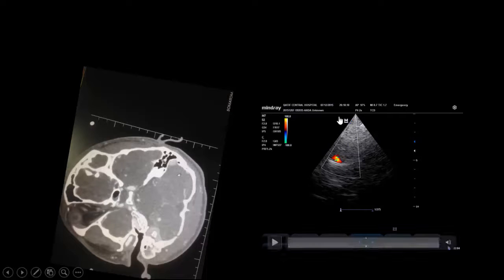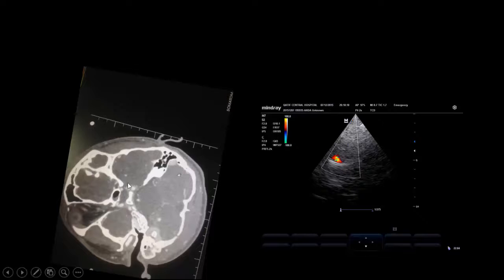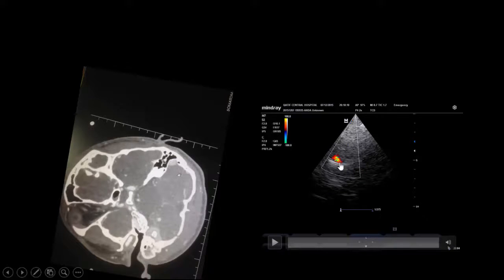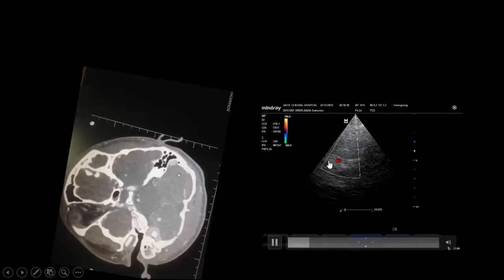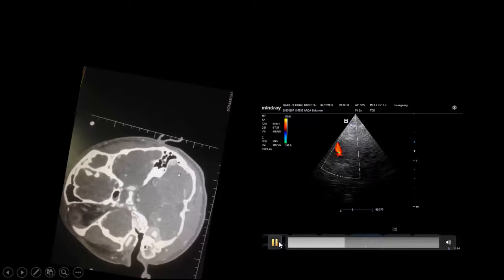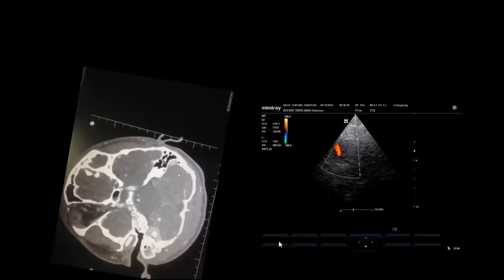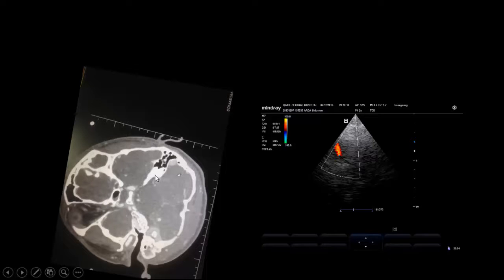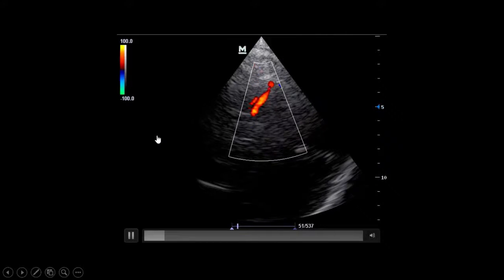On the left side, with the phased array probe in the temporal region — anterior, posterior, lateral, medial — you can see the lesser sphenoidal wing, and the middle cerebral artery passes lateral to it. It is very important to know both the butterfly or Mickey Mouse appearance, and if you cannot find it, rely on the bone landmarks: the lesser sphenoidal wing, the apex of the petrous pyramid, and the upper ridge of the petrous bone.